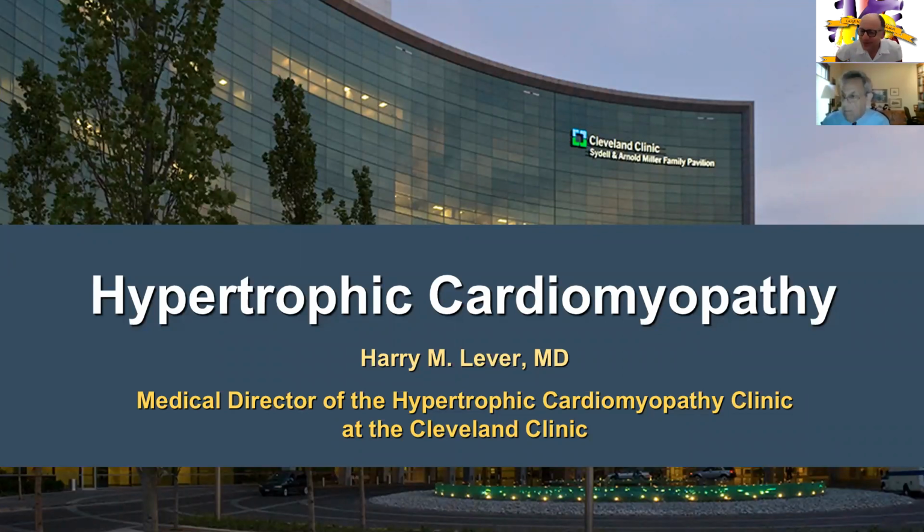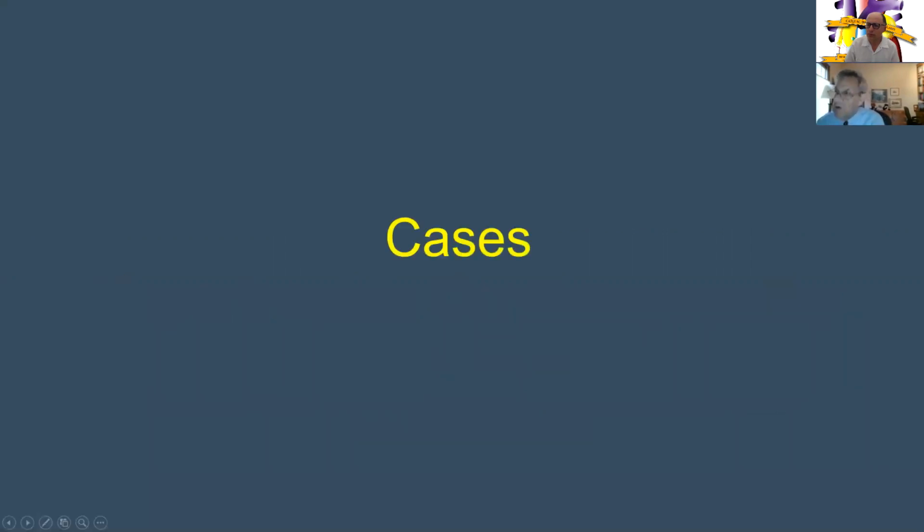Educate us. Thank you very much, Wael. Thanks for this opportunity to talk about hypertrophic cardiomyopathy, which has really become part of my life. First, I'm going to show you two cases to show how there's a broad spectrum of the disease, and then we'll get more into details.